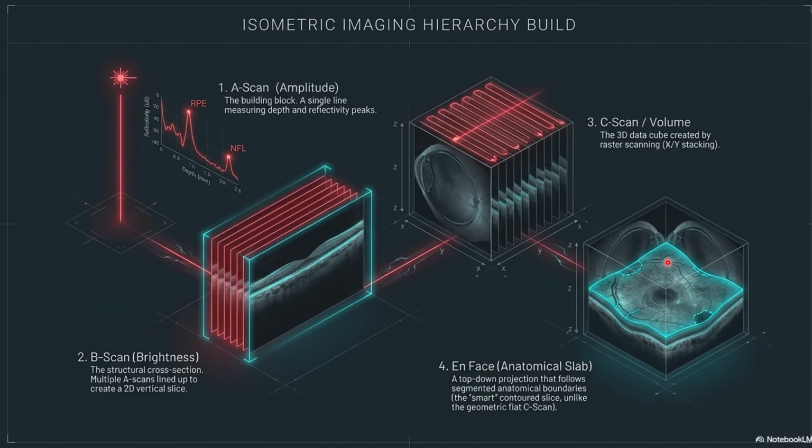But in the eye, we respect the posterior concavity, so that the cut will come through a complete particular layer of the retina, such as the retinal nerve fiber layer, or the retinal pigment epithelium, or Bruch's membrane. If we take a straight cut in a curved structure like this, you will find an area from the nerve fiber layer, then another area from the retinal pigment epithelium, then another area from Bruch's membrane, for example. That's why it is not used in ophthalmology. Why? Because of the concavity of the posterior surface of the retina.